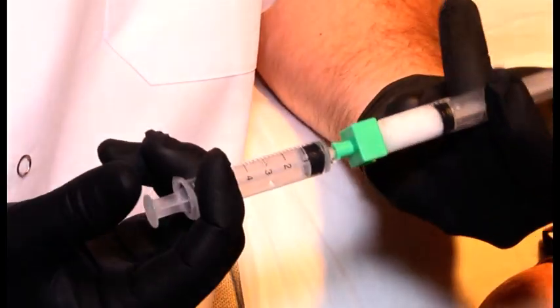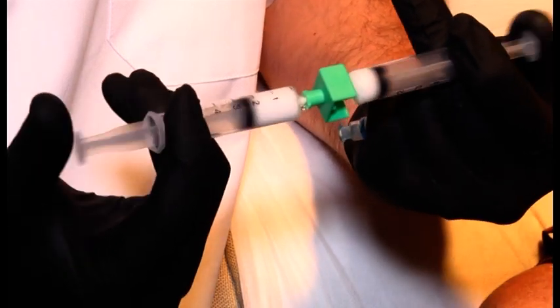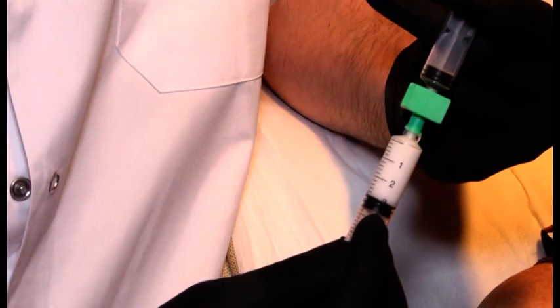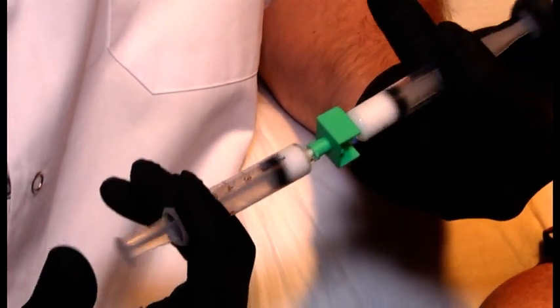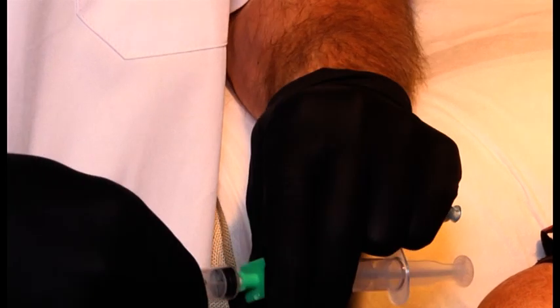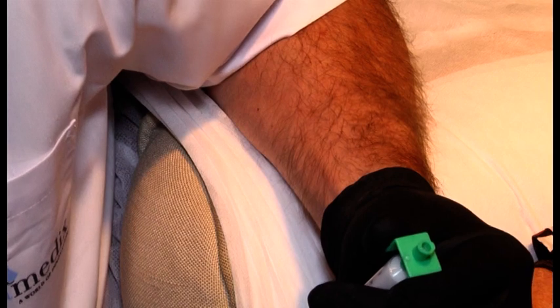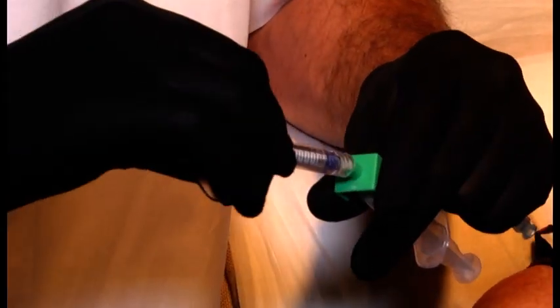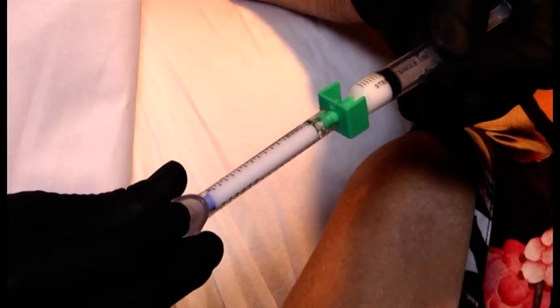for mixing, right? So I have now the full volume of the diluted Radiesse, and as you can see it has 3 cc's, which means that now it's a 1-to-1 dilution and there are no air bubbles inside the system. Then I remove one of them and reattach the Radiesse syringe, and now I can use that Radiesse syringe for the rest of my treatment.